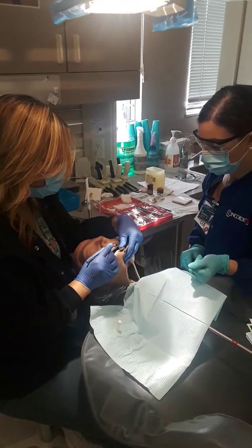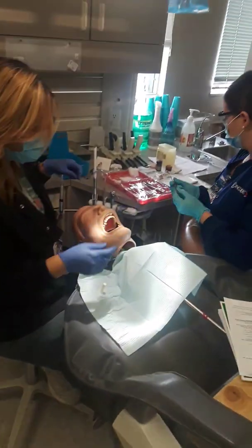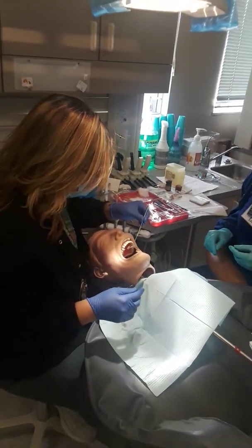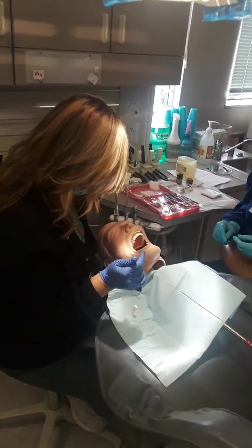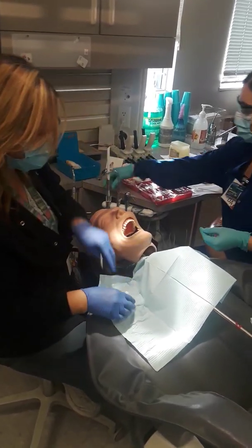Last thing, check the bite. Tap, tap, tap, grind, grind, grind. Then lower jaw excursion. Okay. Check the bite. Bite looks good. How's it feel, patient? Feels really good. Please remove all the cotton rolls. Give them a final rinse.